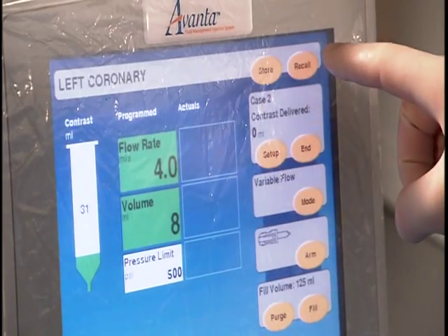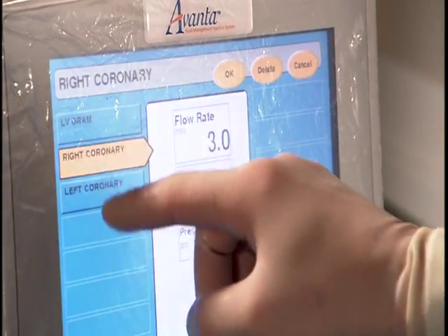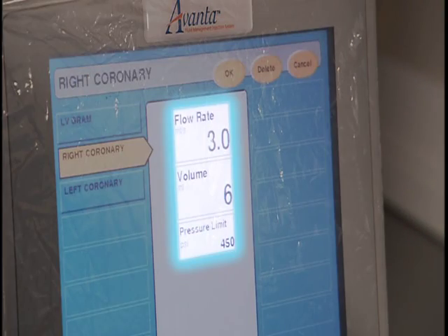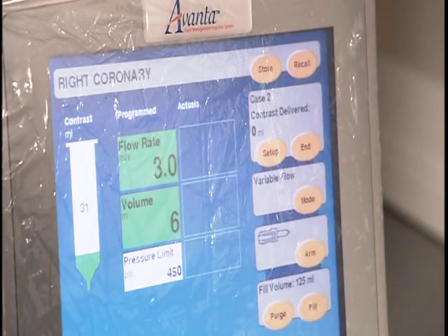To recall a protocol, touch Recall. The stored protocols are displayed. Select the desired stored protocol, and the key parameters are then displayed. Touch OK to select the protocol for use, or cancel.